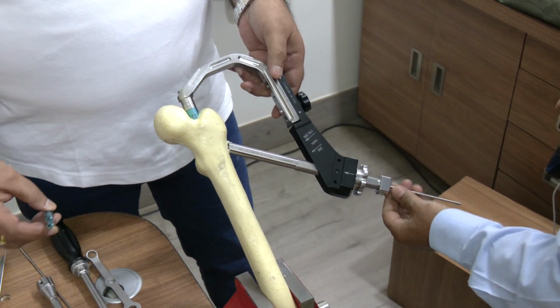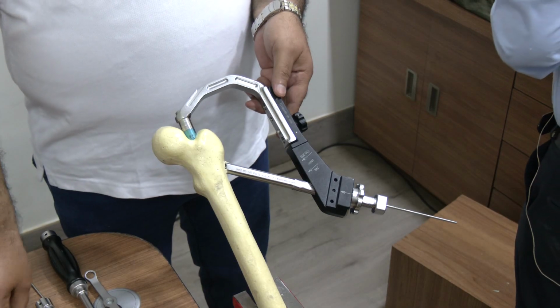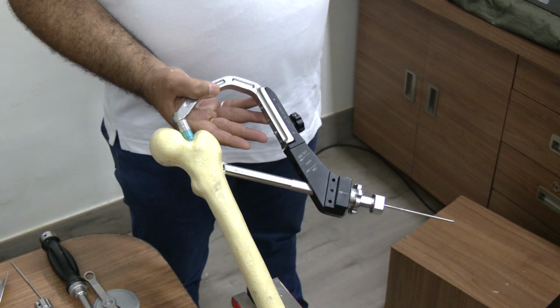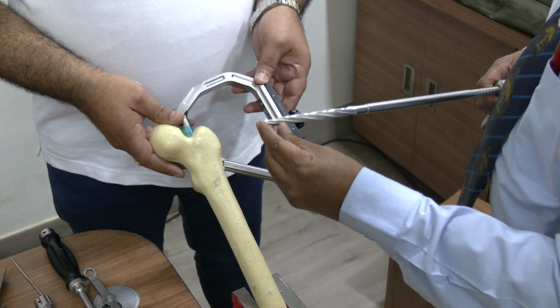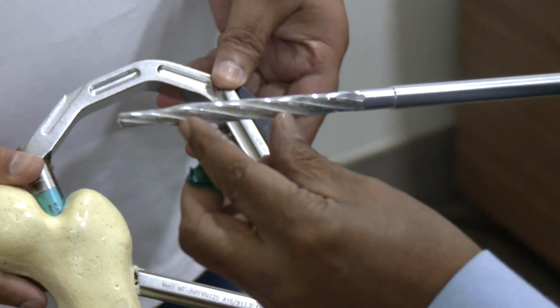Now the next is using the step cut drill. Since we have taken a measurement of 80 millimeter, the step cut drill is used only for the terminal portion for the helical blade, and the proximal portion for the shaft.